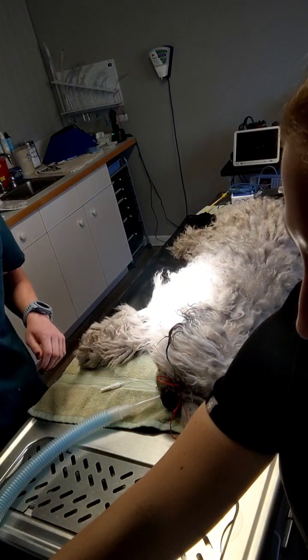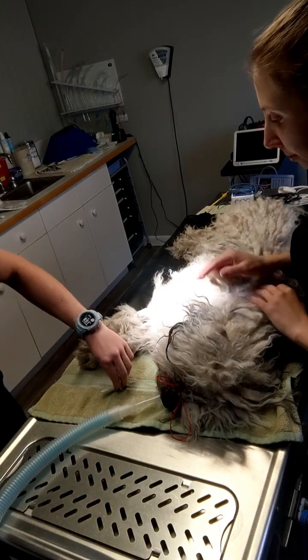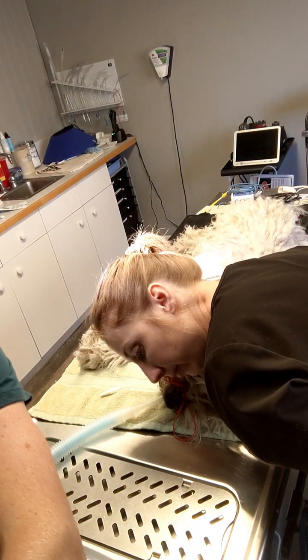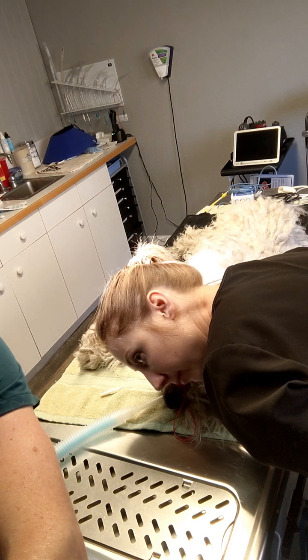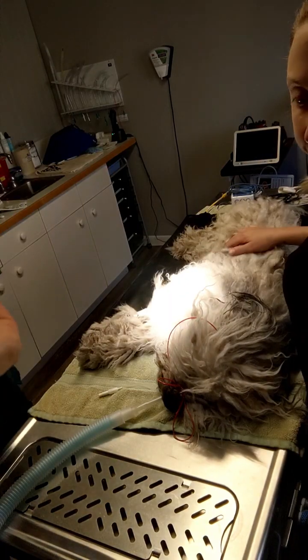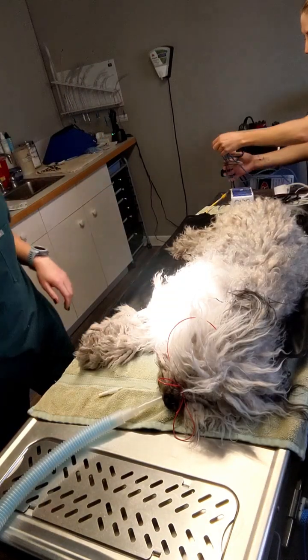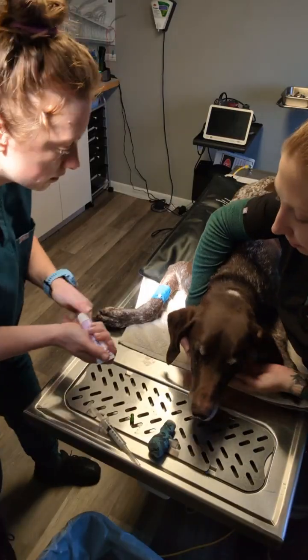Got her set at 2 isoflurane, and we're just gonna do a leak test. So I'm going to close off the relief valve and just put some pressure into our bag. Sounds good to me. And Jackie's listening to make sure that there isn't any air escaping anywhere in this region, so that all of this is flush with the anesthesia machine. And now we will hook her up to our monitoring system.